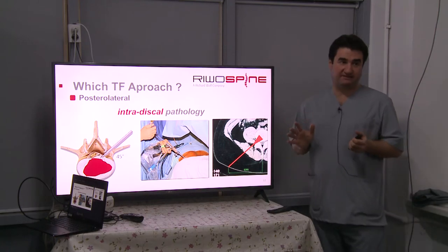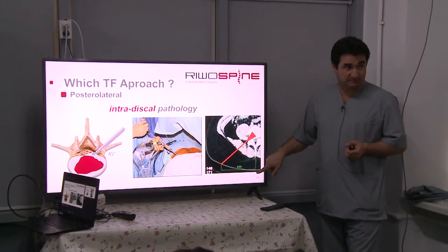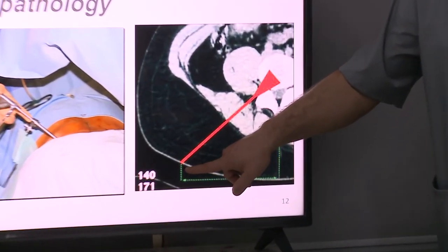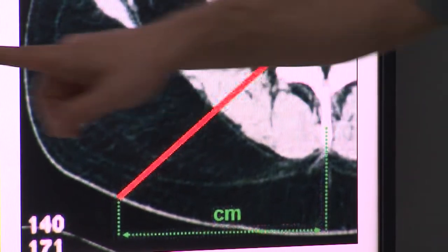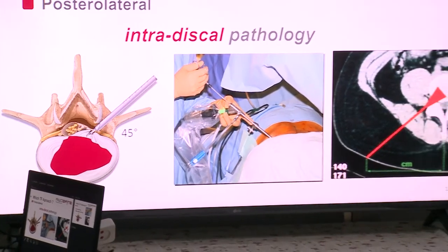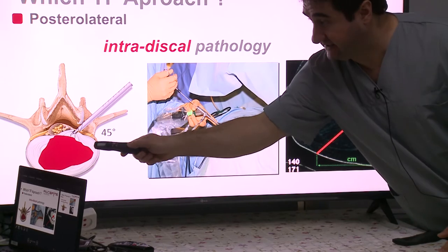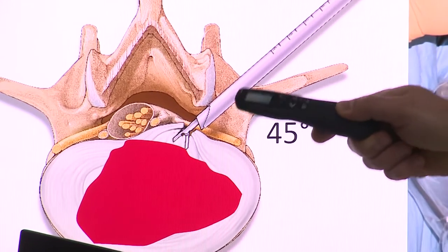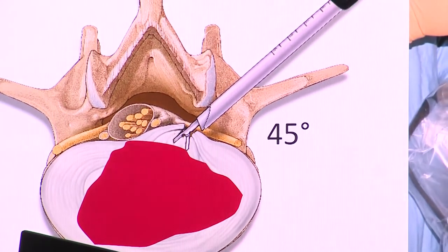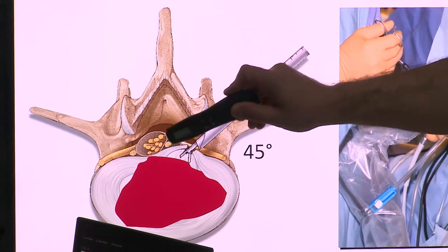What is the posterolateral approach? In the posterolateral approach, we find the midline and then measure 8 or 10 centimeters to the lateral. Then we find the entry point. By this way, the working angle is 45 degrees. But we go inside the disc here, you see, inside. It's not easy to go to the ventral part because there is a facet joint here. If you choose posterolateral like that, you have to resect the facet joint to reach the spinal canal.